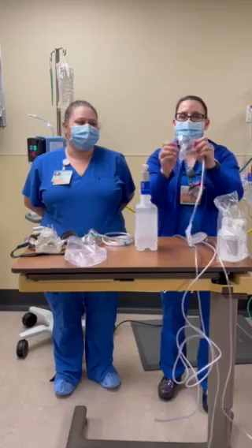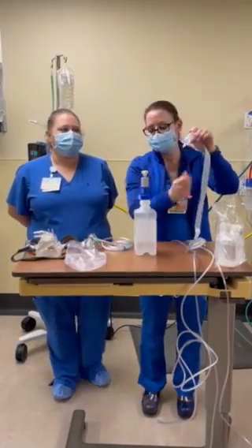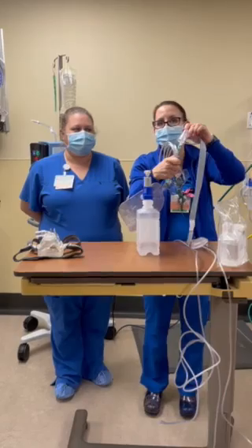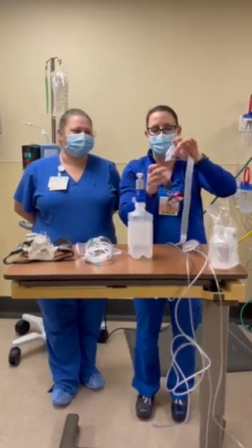Next up is the trach collar counterpart to the Oxymask. This is the Oxy-Trach mask. You can either hook up O2 tubing to this, just to put them on a low liter flow, or you can max this out at 15, okay?